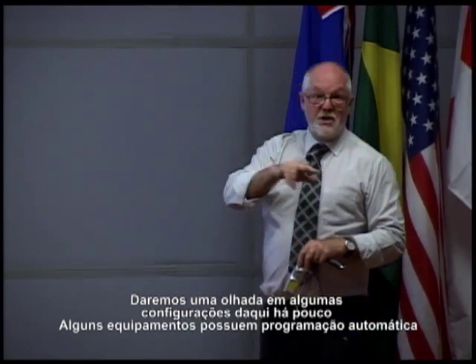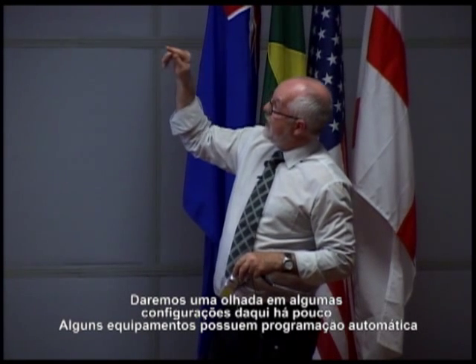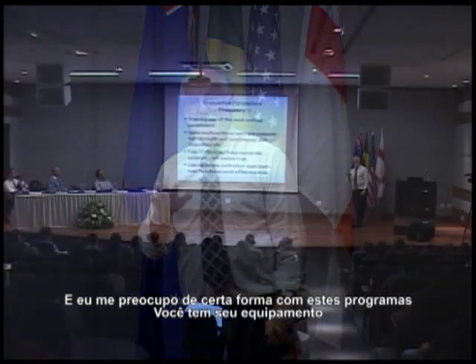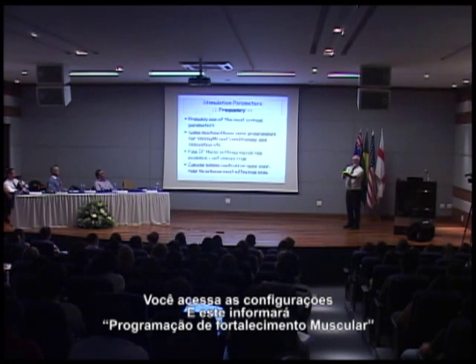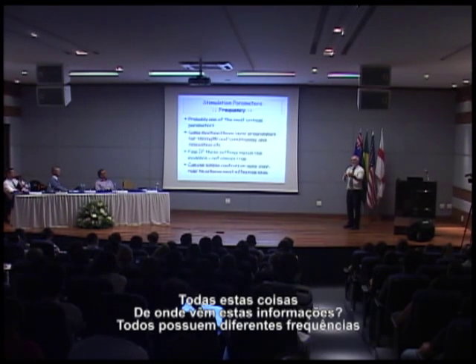We'll have a look at some settings shortly, but some machines have got automatic programs on them, and I worry slightly about these automatic programs, because you'll open up the settings and it will say muscle strengthening setting, muscle relaxation setting, and then something about a recovery setting, and all these things. Where do those settings come from?